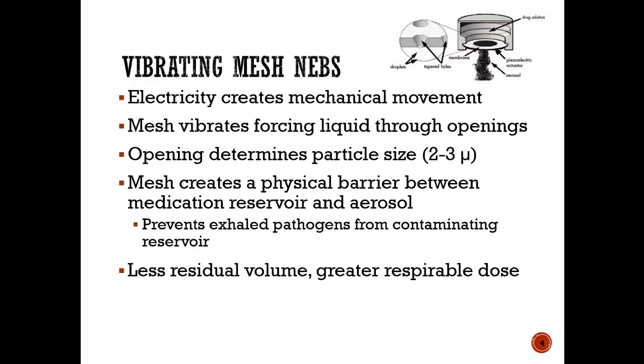Very cool. So electricity is what's actually going to create this mechanical movement. And then when the mesh vibrates, it forces like the liquid neb through these openings. Depending on how big the mesh is, it's about 2 to 3 microns for the med delivery. The mesh creates like a physical barrier between the medication reservoir and the aerosol, so it prevents exhaled pathogens from getting into the reservoir, so it's pretty clean from an infection control standpoint.